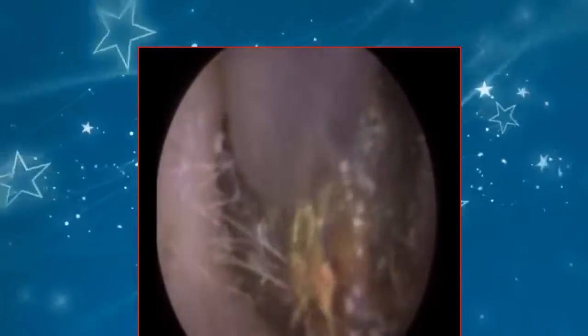We're now doing the left ear, so the left ear was a lot more impacted, a lot more occluding. The ear canal was slightly narrower near the entrance as well. Most ear canals are more of a rugby shape or an American football shape, so it's more oval than it is circular. But with this particular client, the entrance itself was quite elongated. That oval was a bit more oblique. You can see the patient's got a lot of dry skin in the ear canal. That's quite common in elderly patients.